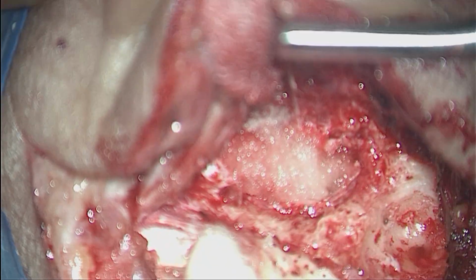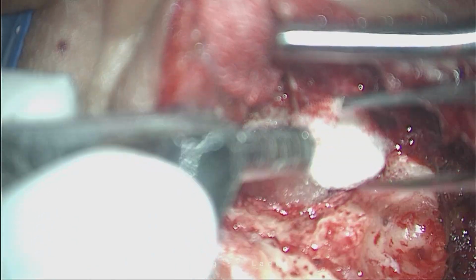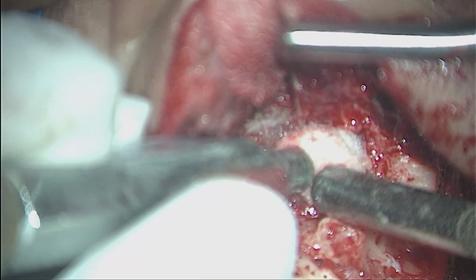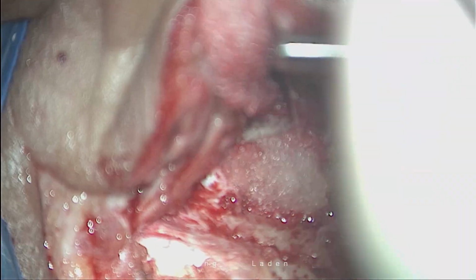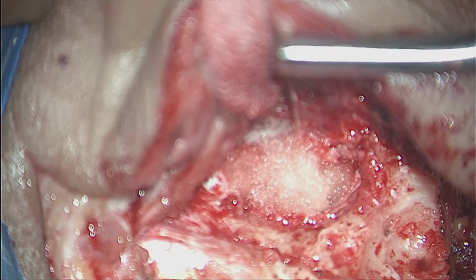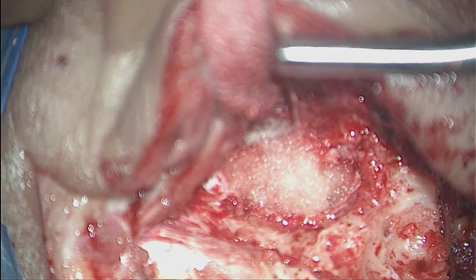So this is simply the beginning of this prestigious conference, this live surgical session with one of the commonest, we call it the basic surgery, the most commonly performed surgery in otolaryngology, that is tympanoplasty. And we still look for better and better results by overcoming all the disadvantages of the prevailing techniques. So still we strive to do better for better results.